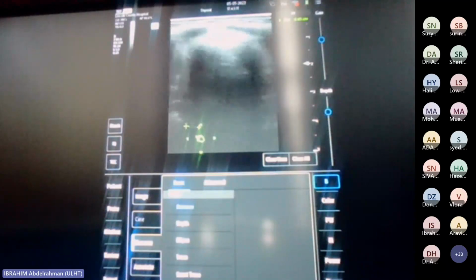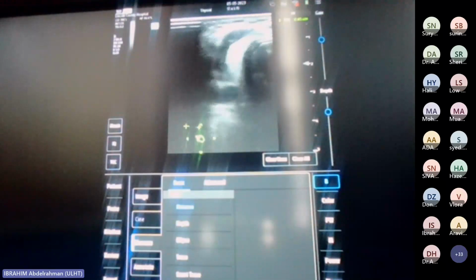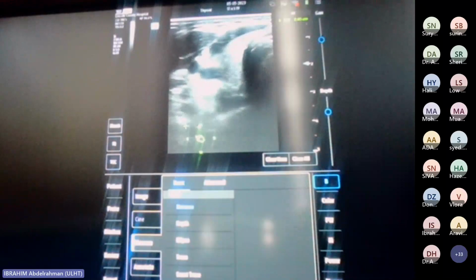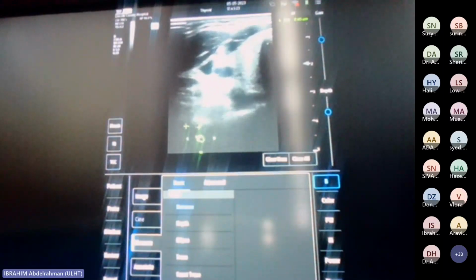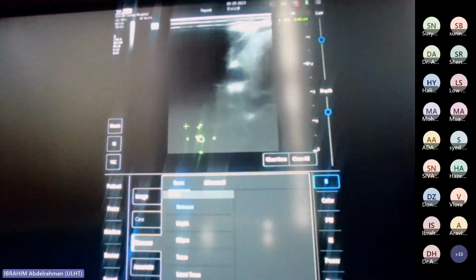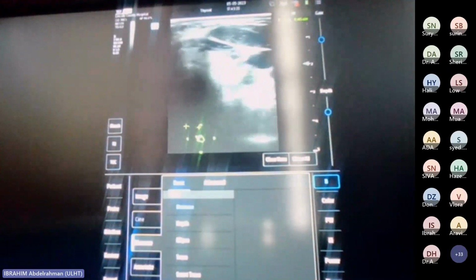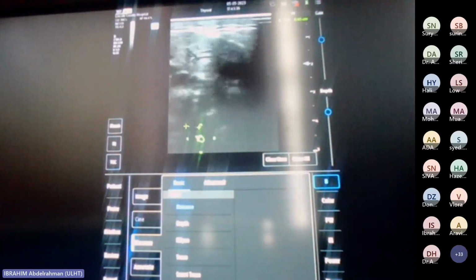So it depends on the patient. In the lateral neck, I would be thinking, first of all, is this a lymph node? But then what you want to be thinking is, where's the anatomy? What's it doing to the anatomy? A bit like the parapharyngeal space. If it's pushing the submandibular gland down, it'll be a level 1B lymph node.